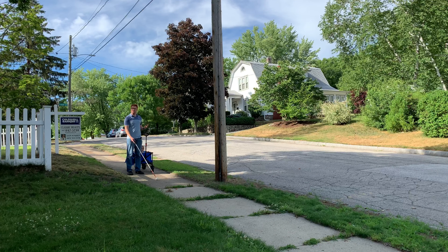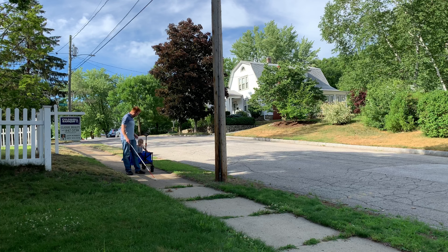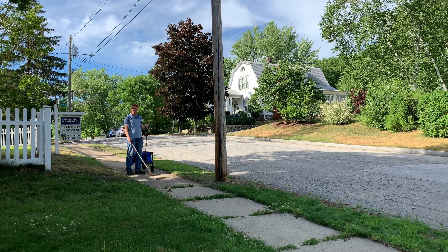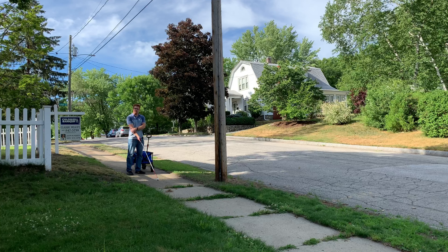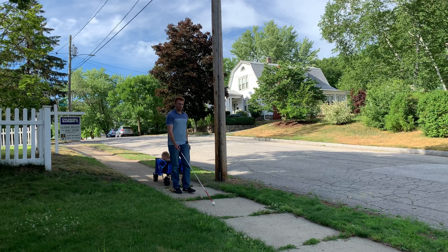Now for my second alternative — using a wagon that you can pull behind you. Instead of pushing a stroller in front of you, you can use a wagon as a way of still having your cane out in front of you and pulling the wagon. Here I'm on that same residential sidewalk. I have a blue wagon and my toddler sitting in there. They do make wagons with seat belts or ways to buckle in either a child or a toddler, so I definitely recommend that if you're going to be using this option. I have the wagon in my left hand, the handle, the wagon's behind me, and the cane is out in front of me, so I still get full function of the cane while pulling the wagon behind me.